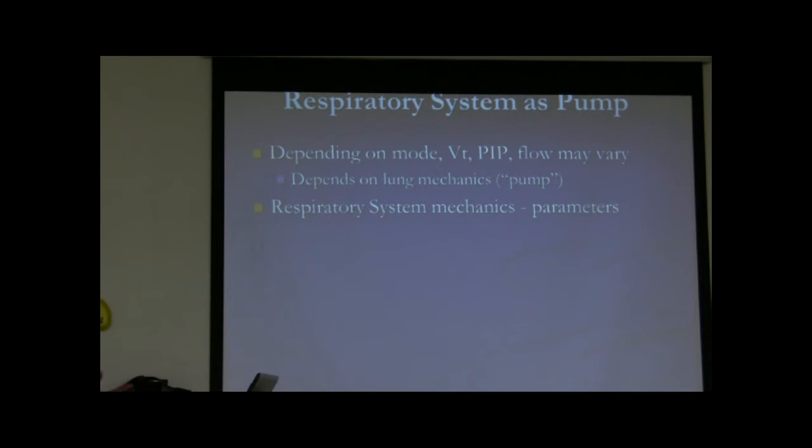In order for the pump to work, you need the chest wall, you need the muscles to all fire and contract, and all that to move so that the actual parenchyma of the lung can do the gas exchange part of the whole phenomenon. And any one of these things, if it's off, can lead to dysfunction. Now, when a patient is receiving support from a ventilator, you have to take into account what are the things that the ventilator is doing that are impacting that whole balance.